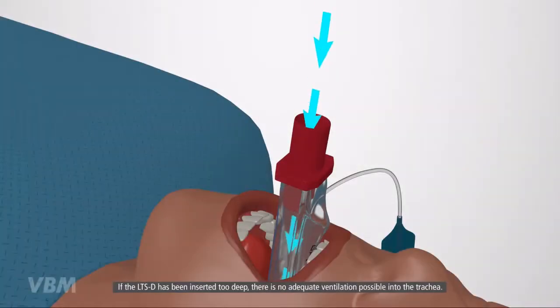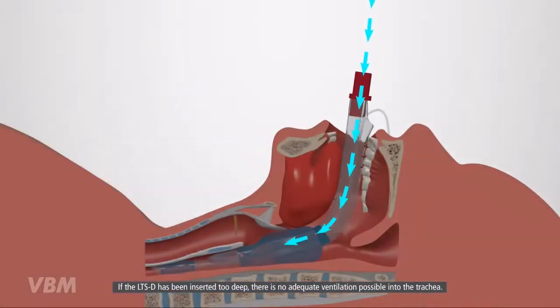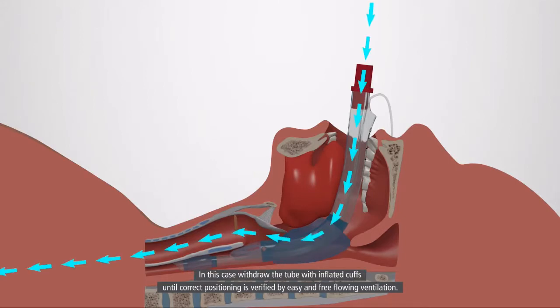If the LTSD has been inserted too deep, there is no adequate ventilation possible into the trachea. In this case, withdraw the tube with inflated cuffs until correct positioning is verified by easy and free-flowing ventilation.